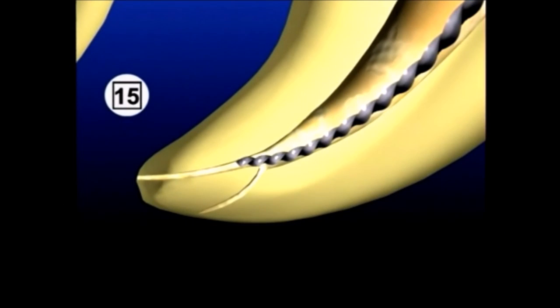We pre-curve 10 and 15 hand files. We exaggerate the curve, we use unidirectional stops, and we work the instrument past the bifidity. When the instrument is at length, we work it gently and repeatedly in vertical amplitude strokes.